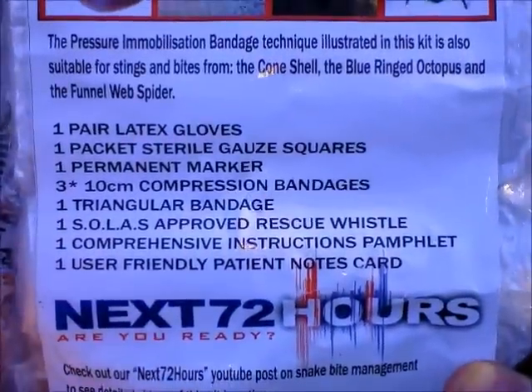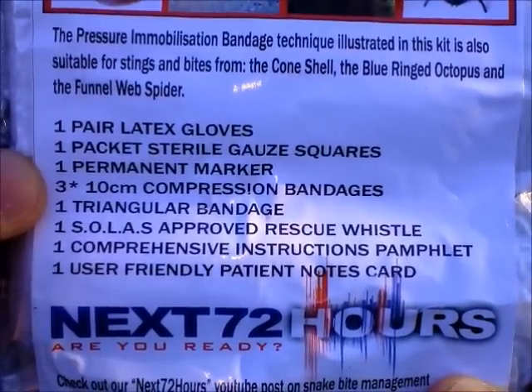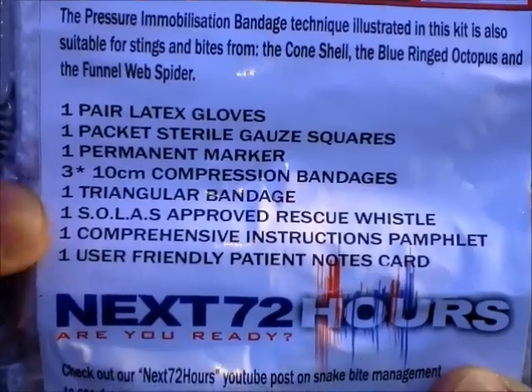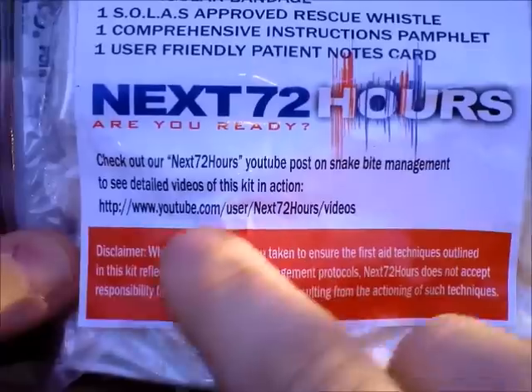Moving down a bit more, we'll have a look at the contents. You've got a pair of latex gloves, a packet of sterile gauze squares, a permanent marker, three 10 centimeter compression bandages — which is vitally important — a triangular bandage, one SOLAS approved rescue whistle, a comprehensive instruction pamphlet, and a user-friendly patient notes card.